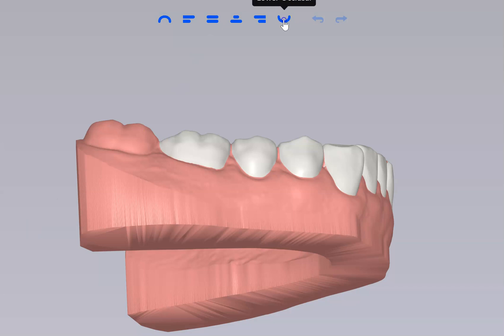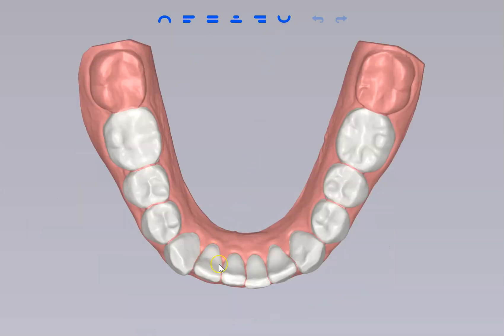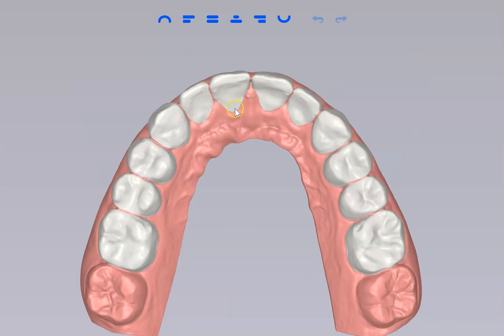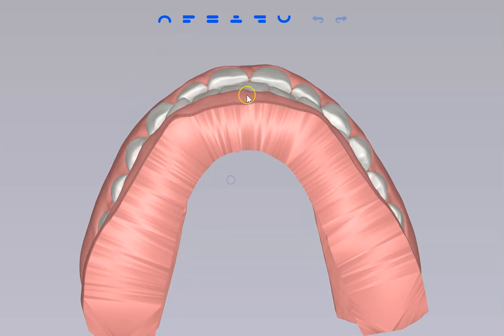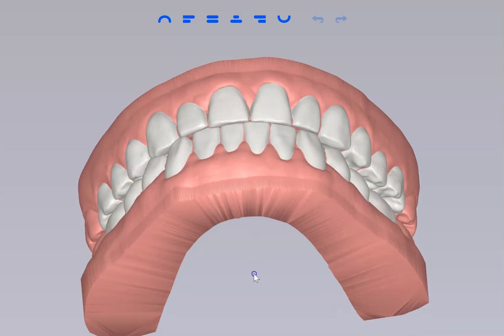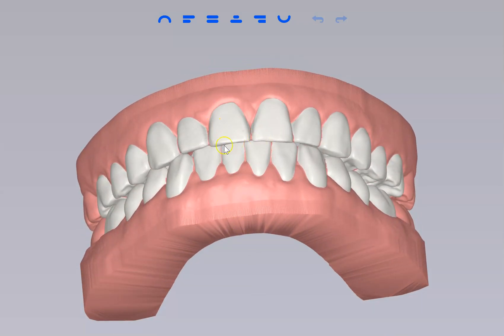If you look from the top, you'll be able to see we've got some alignment issues down there on the bottom. On the top, not so much. And you do have smaller lateral incisors — these two teeth right here are a little bit undersized. That all makes it so that the upper and lower teeth don't really fit together great. See how the upper teeth are sitting right on top of the lower teeth? That causes them to wear and causes some flattening of those teeth.